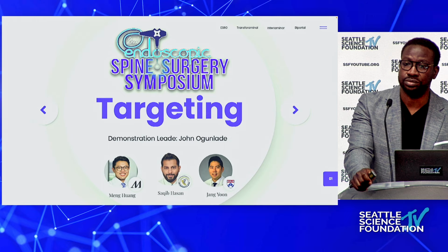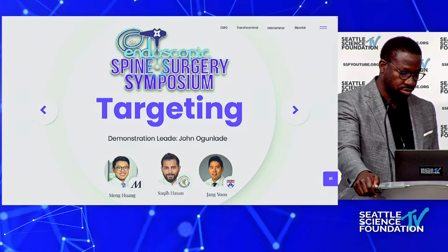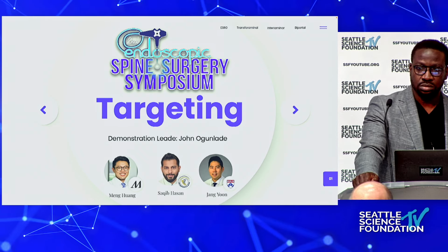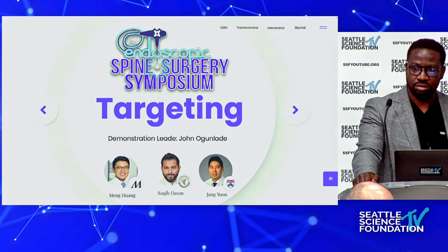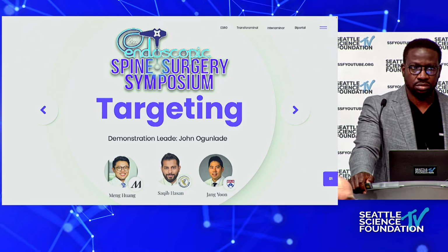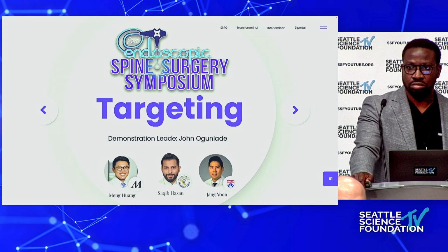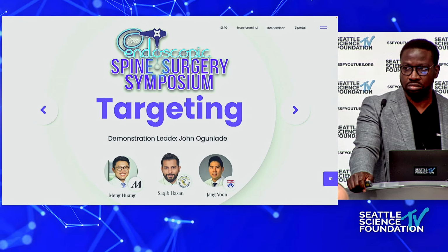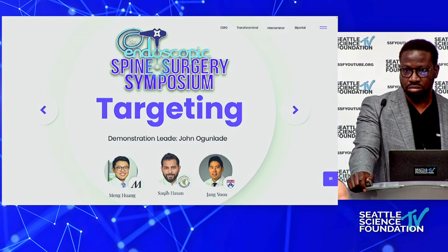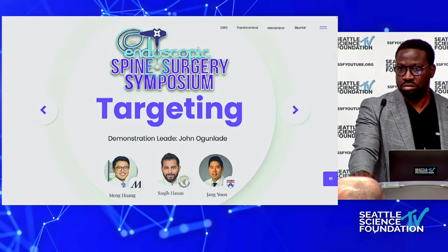Just one thing for the audience here right now. A lot of people have done endoscopy. So who has gotten lost here from the skin to the target area so far during their career? Anybody else? Yeah. Okay. And does anybody want to share why that happened? Because this is really important. Targeting is why you wouldn't embrace it, because you're like, from this point on the skin, I have to get right there. And if you get lost, you're really lost, right? You don't see anything, you see muscle tissue. So anybody want to share their experience while we start?